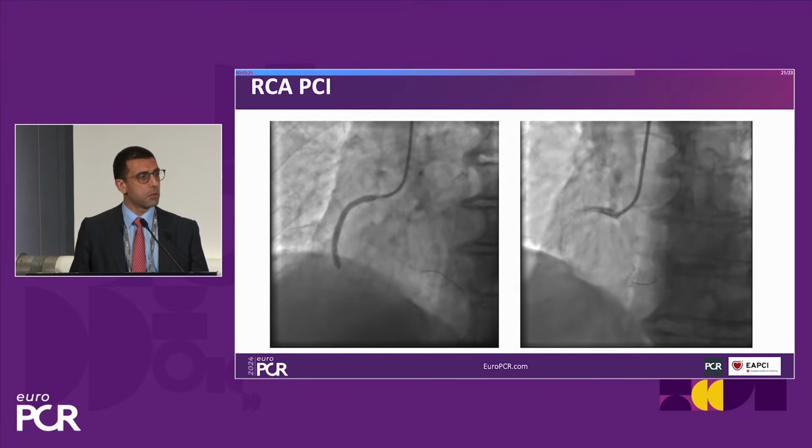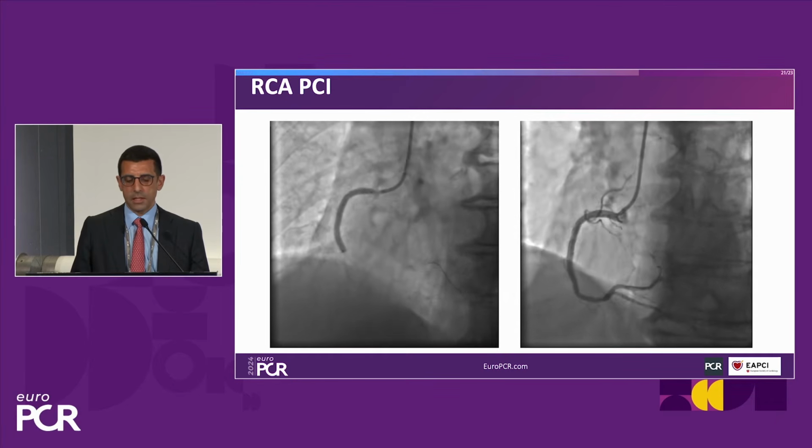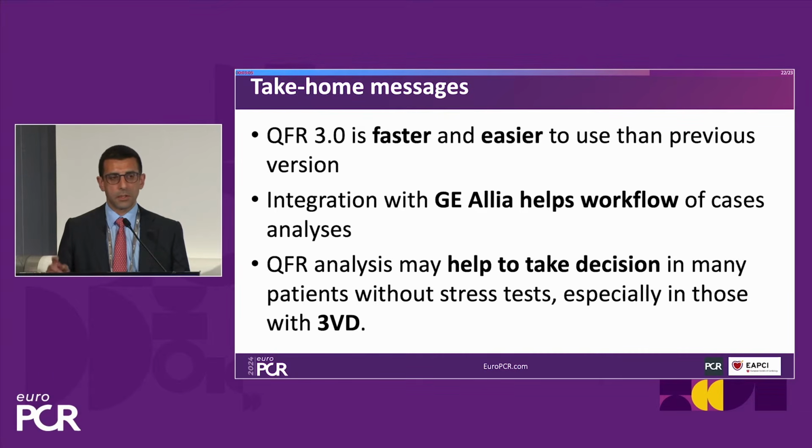The patient, 2 months have passed, he's still okay, he doesn't have angina now. So these are my take-home messages. As you have seen, QFR is faster, easier to use. To me, both characteristics are important, not only the time that you consume, but also the fact that you just have to click on next, you don't have to do much more drawing.